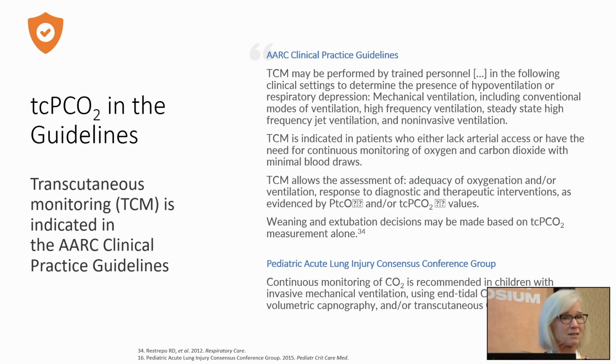Now, when I tell you that, I would want you to use the monitor for yourself, learn how to trust the monitor, learn how to use it properly. And when you do that over time, you will say, okay, actually we can really trust this. And I would go ahead and say that as a respiratory therapist, you could probably look at your patient and guess what the CO2 is, and you'd probably be within 5 points if you've been practicing. That learning curve would go up the longer you practice, the more accurate you can get.